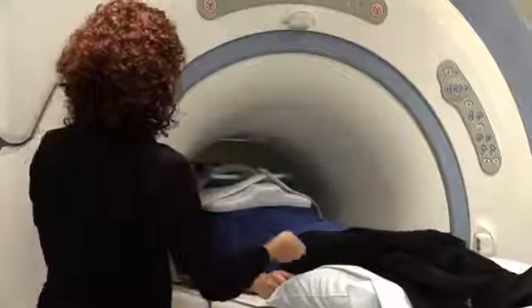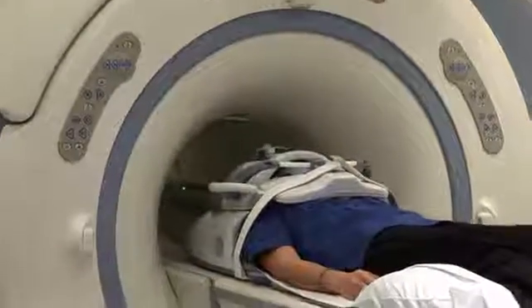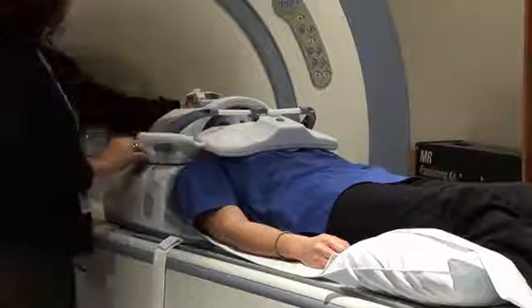The MRI has many advantages over other diagnostic imaging techniques. MRI systems do not use ionizing radiation and therefore have a very low incidence of side effects. MR has great tissue contrast. It has pretty good spatial resolution. It can be acquired in 3 orthogonal planes, but also multiple planes of obliquity.